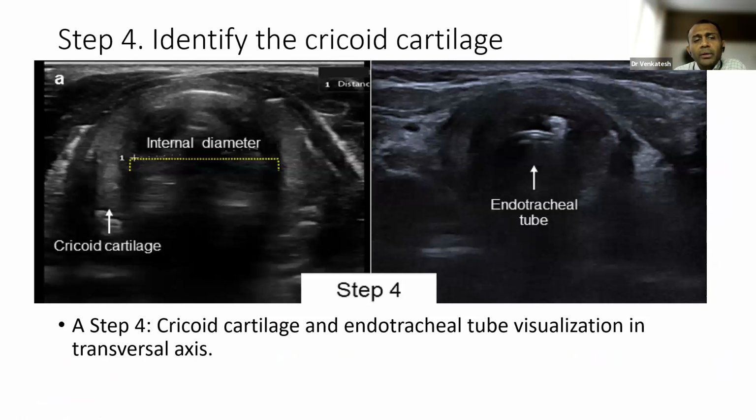So identifying the cricoid cartilage is very important, so that in case you lose access to the airway, you may consider cricothyroidotomy. So you try to appreciate the cricothyroid membrane also, for membrane access in case you lose important airway control.